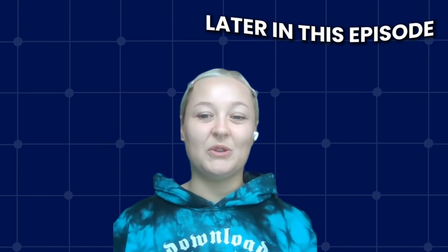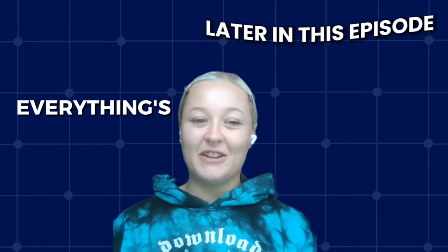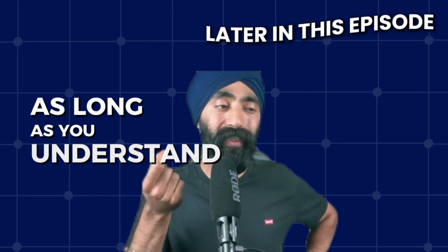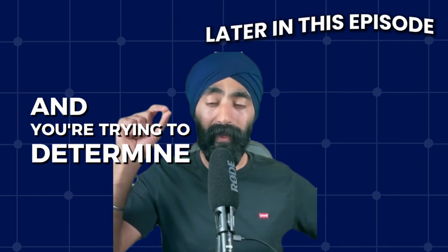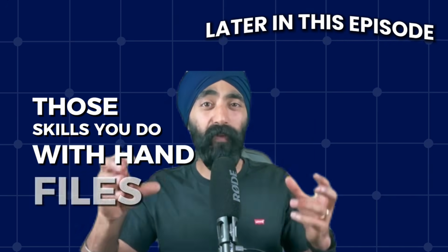When you go to dental school, you're going to be using hand files. You're going to get taught with hand files. Everything's going to be hand files, and that's how you're taught in dental school. As long as you understand, when you're trying to determine tug back and the master apical file size, for example, those skills you do with hand files and they're universal.